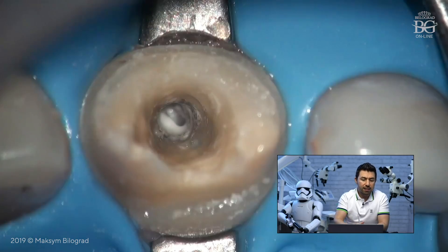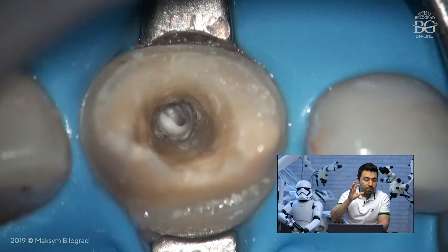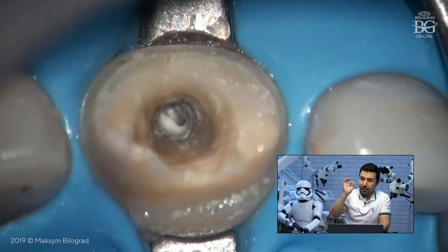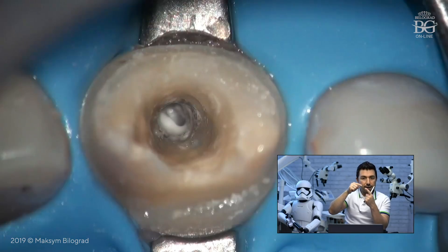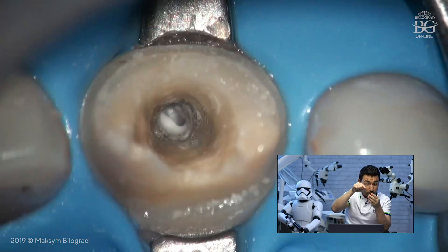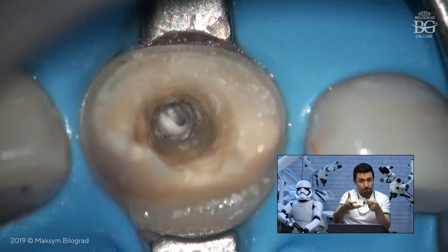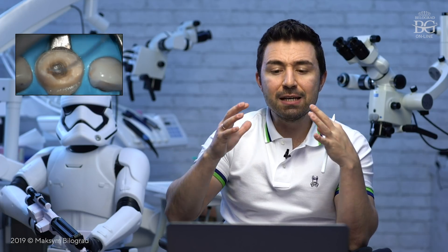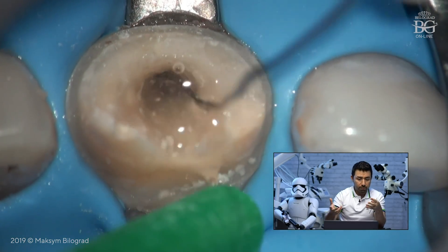We have to neutralize the pH. Here is a tip: clean and irrigate the root canal, then take your calcium hydroxide with your hand plugger and put the calcium hydroxide exactly into the apical part into the periodontium — you will see a white spot in the periodontium. Calcium hydroxide itself has a really high pH. Then we go with unmixed MTA — literally using the powder of the MTA, not mixed.